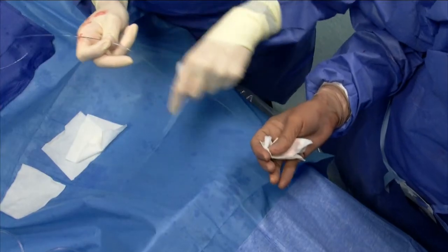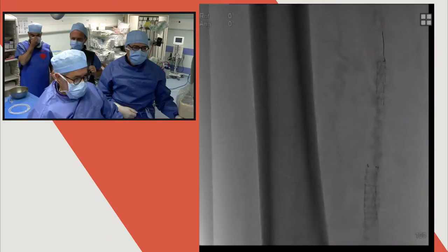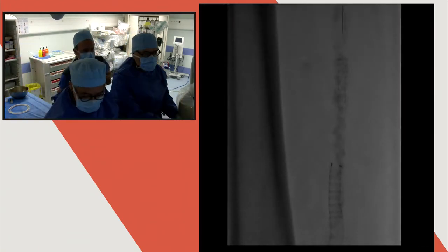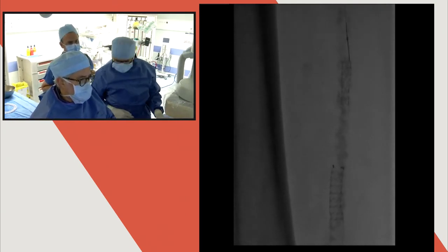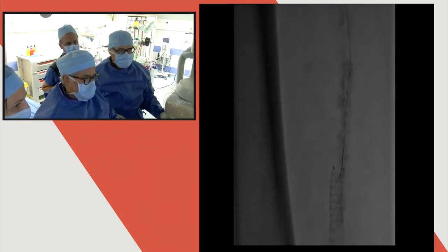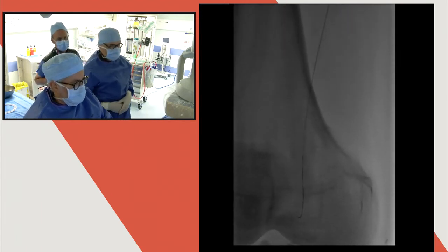It's an old balloon expandable stent, Palmaz, that has been placed several years ago in a calcified territory. Okay, here we are. You are across. There's a lot of resistance. So here we are inside the stent. That's okay. We don't need to move further down.